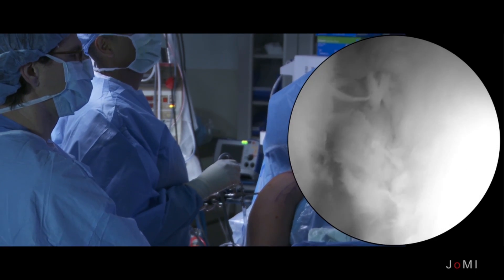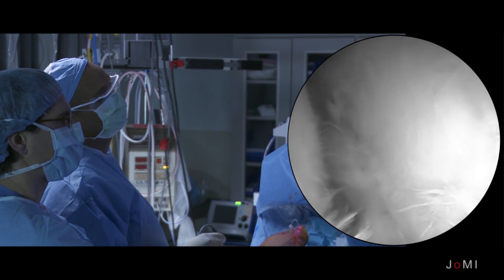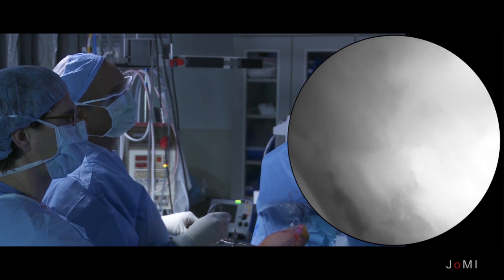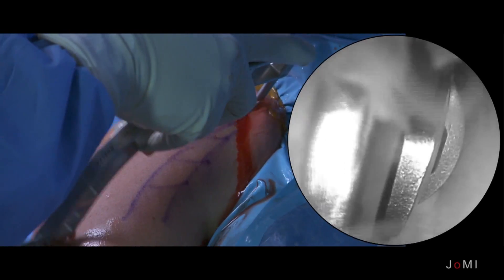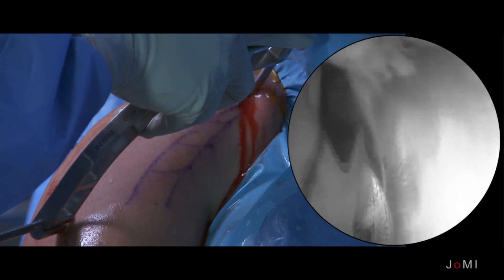When we first put the scope in the shoulder, I'll do a routine diagnostic arthroscopy — look at everything, make sure the rotator cuff is intact, make sure that the chondral loss is what I thought it was going to be before the surgery. And then size up the humeral head and the glenoid graft sizes, because there are different sizes I can transplant.